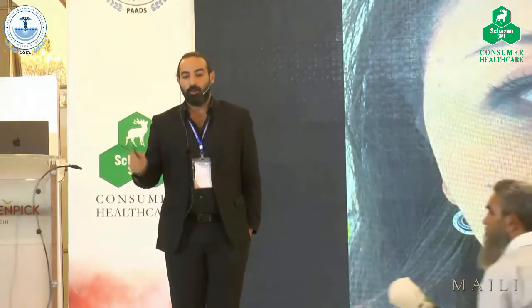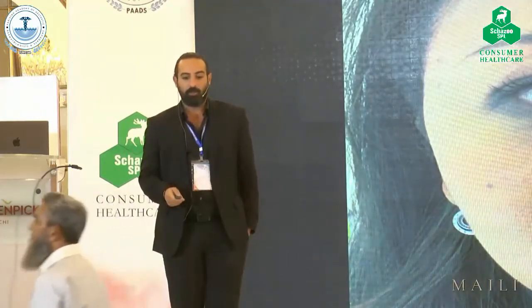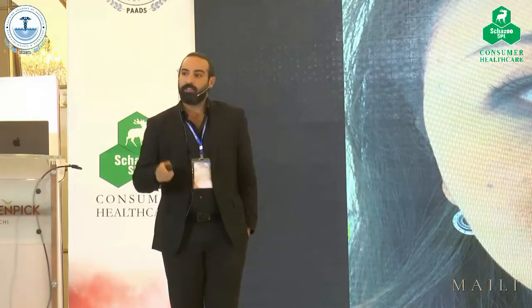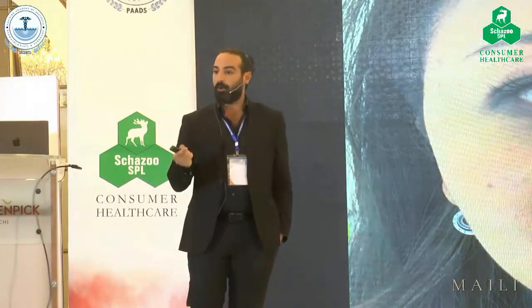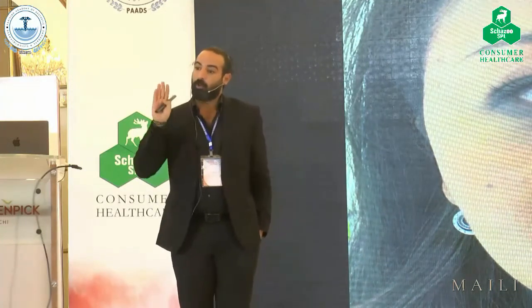All you need to do is, for example in this case, just add a little bit behind and in front of the hump. Those are Francesco's photos. With the Asian nose, you need to be very careful because there's a certain limit you could give, not more, because adding more might compress arteries and vessels in that area.